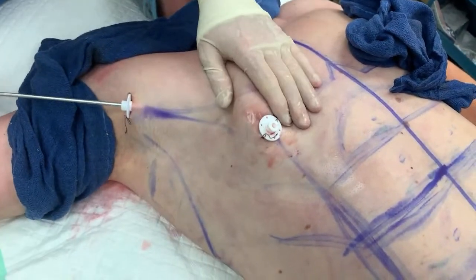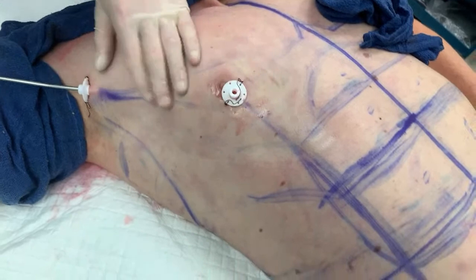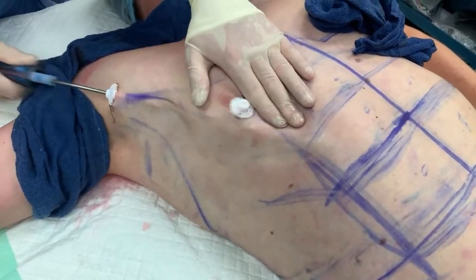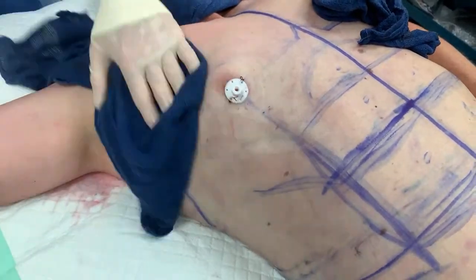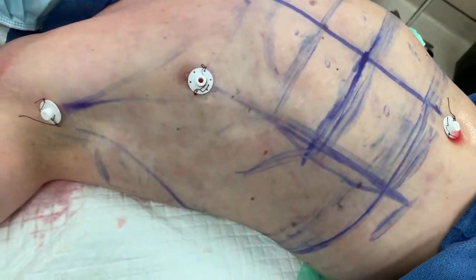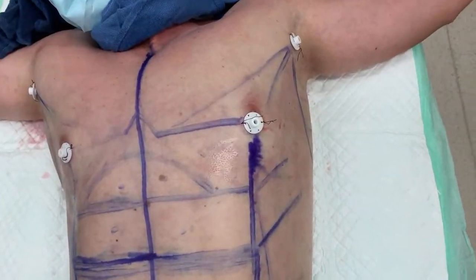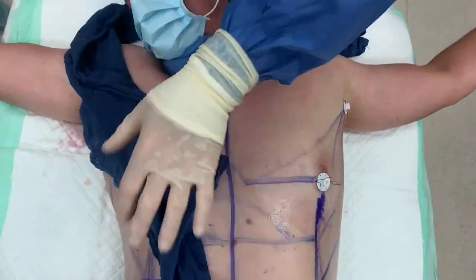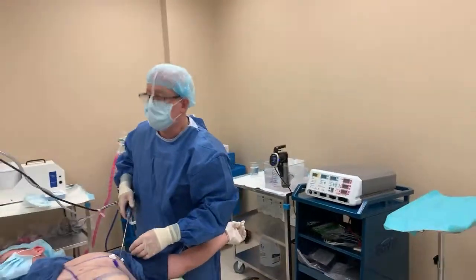Put down the arm a little bit — maybe that'll help. Now I'm under it, and we're gonna get that gland out shortly. Let's leave this alone for now. You can kind of see the difference already — see the difference between this side and this side? Also this gland versus this gland. Let's get another 600 on this side.